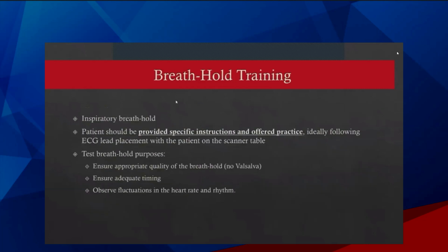As far as breath hold for the patients, it's good to rehearse breath holds with the patients so they know exactly how you want them to hold their breath. Sometimes people have harder times holding their breath, so it's good to practice and just notice the rhythms and the patterns that the patient has when they're holding their breath. So you should really give them specific instructions and tell them exactly what you want them to do.